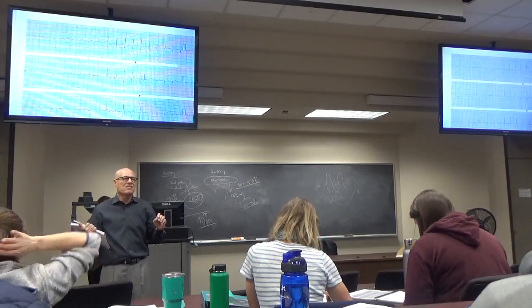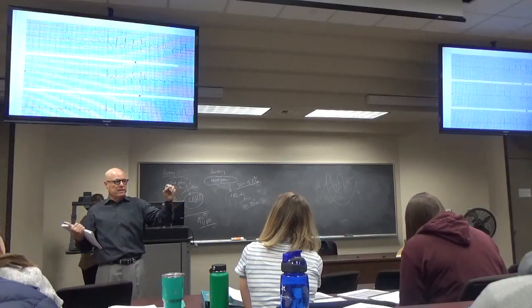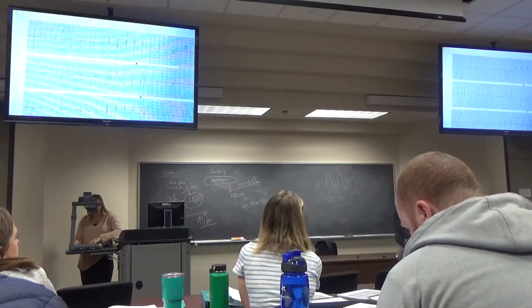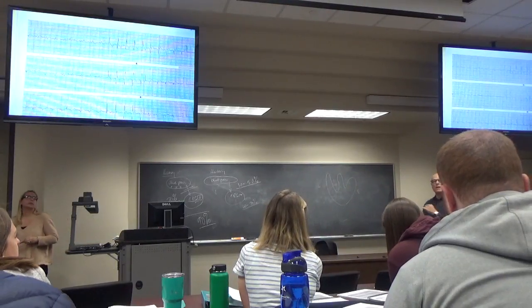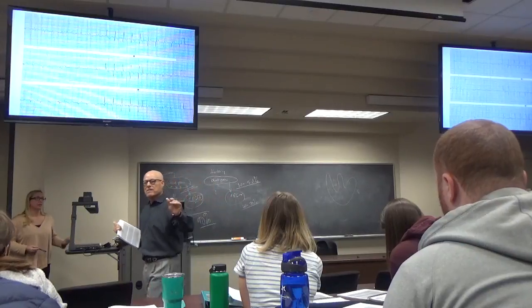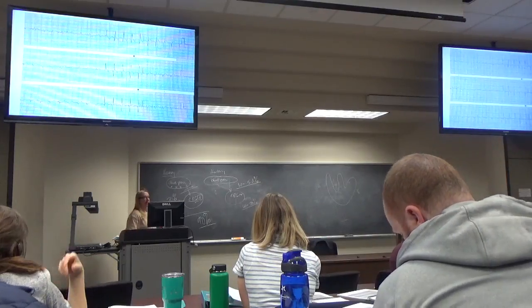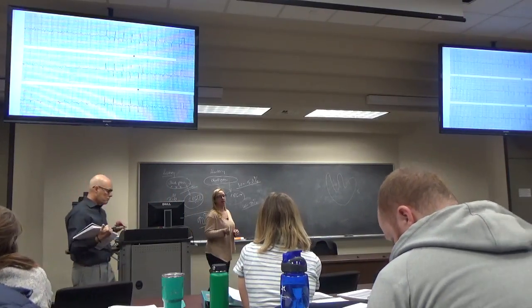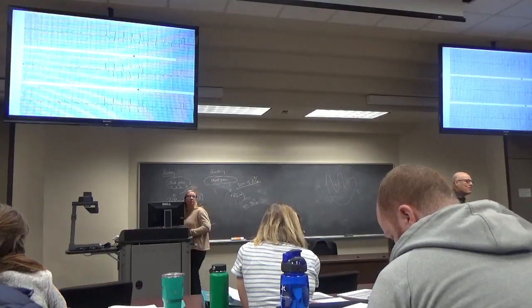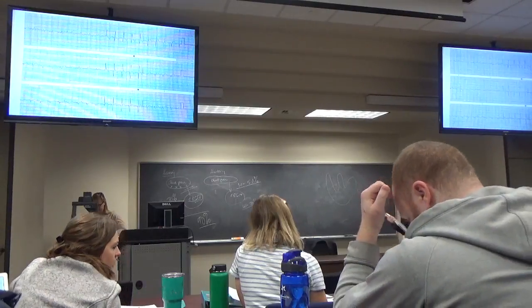Why are they multiples of 300? Because 300 is the atrial rate in atrial flutter. I used to say 280 to 320, which is more accurate, but I really like the way Jacob just defaults to 300. It's much easier. So that's the rule that you will use to rule that out. Look at the atrial rate, and if the ventricular rate is not a multiple of 300, then that rules it out. Almost every time. Every time is too big a word.